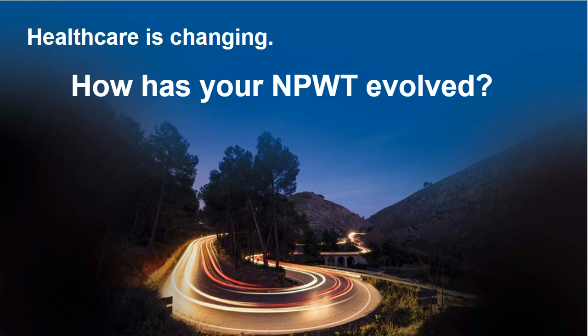Yeah, again, I think it's an interesting question. The fluctuations that we had seen, and most specifically the final chart, I think might be what we're referring to here. There was a spec range called out on that chart, and it was a spec range that we actually took from prior poster sessions at wound conferences, where the incumbent product, the largest and most commonly used device in the market today, called out their own specification range of plus or minus 10 millimeters of mercury. So we really measured our product against what that previous poster and that other company had themselves called out as the desired specification range for the product on that poster.